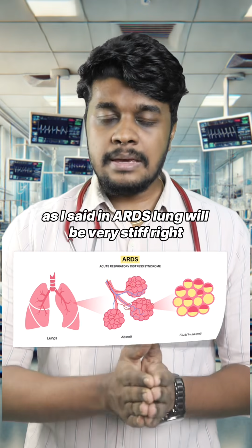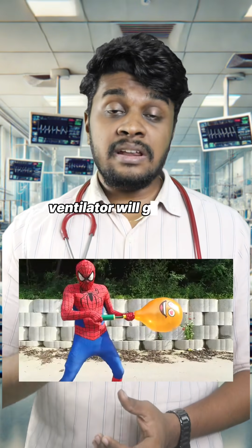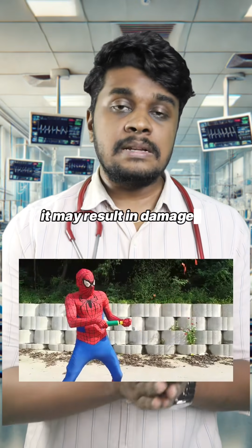As I said, in ARDS, the lung will be very stiff, right? So if you select volume control and fix a particular volume, the ventilator will generate an enormous amount of pressure to deliver that particular volume of air. It may result in damage to the lungs.